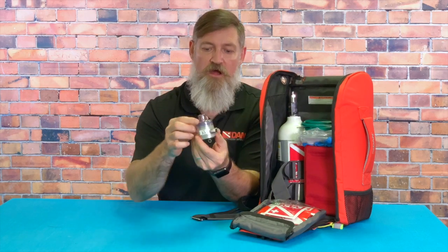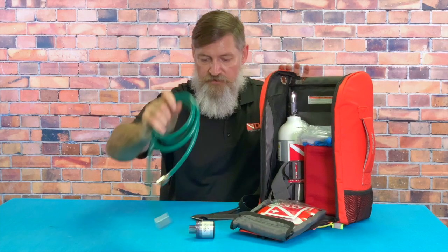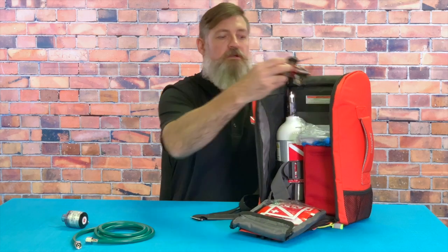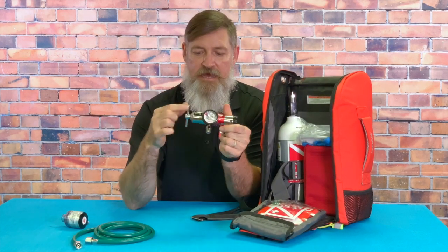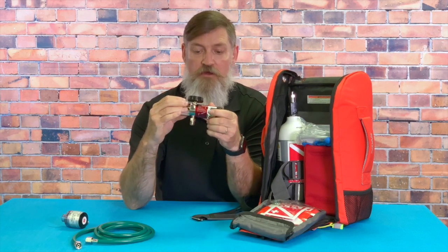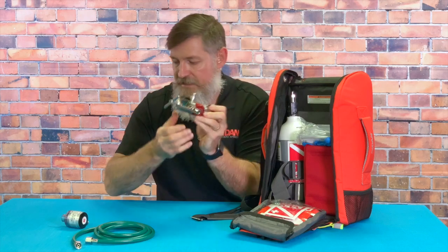First of all, we've got some of the loose units. This is the demand valve — we'll connect everything up, we've got the hose, and the multi-function regulator with a T-handle to fasten it onto the valve. It's got a dial on the side for the free flow, your SPG gauge, your free flow barb, and your disc outlet ports.